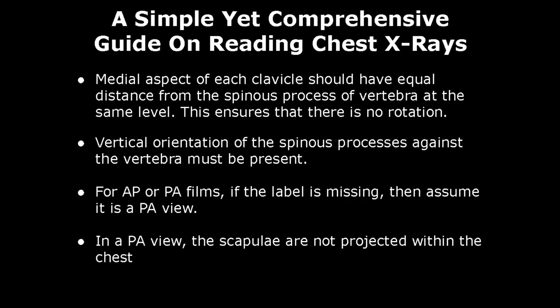If you receive a PA view or an AP view and there is no label indicating which view is taken, then you can assume that it is a PA view, because a PA view is more commonly used. Also, in a PA view, the scapulae are not seen within the chest. They are seen outside the chest.